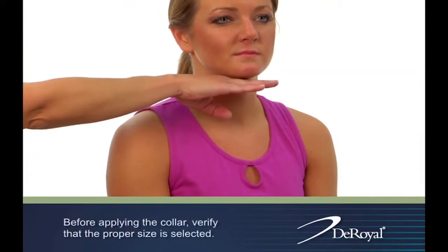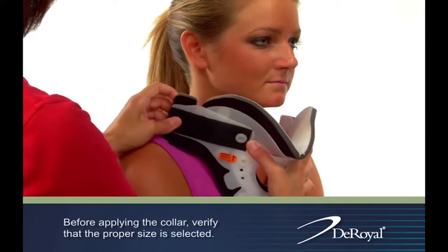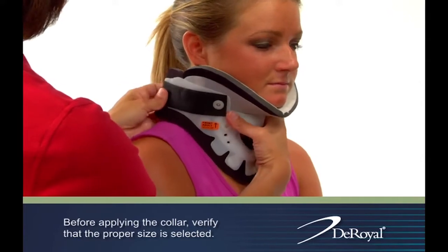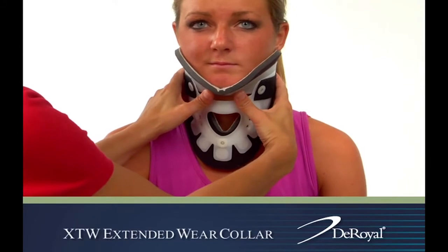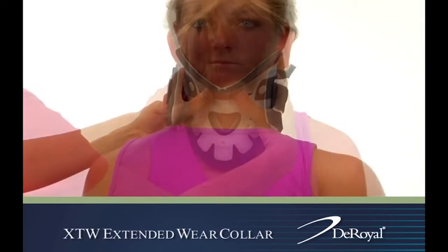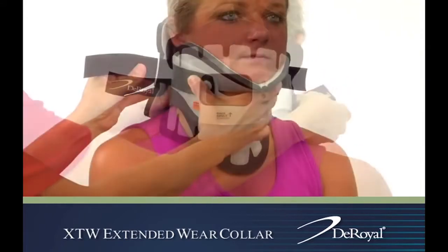Before applying the collar, make sure the patient is in neutral alignment. To apply, slide the front portion of the collar up the patient's neck and properly position the chin support. Center the back portion of the collar onto the patient's neck.